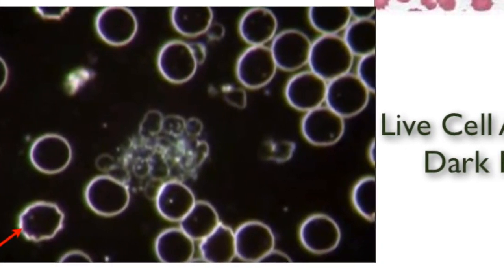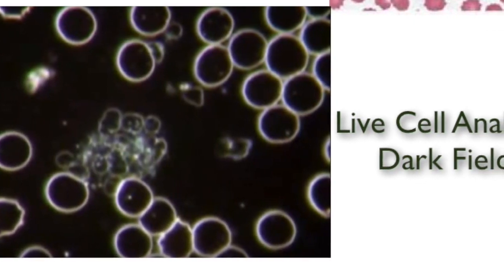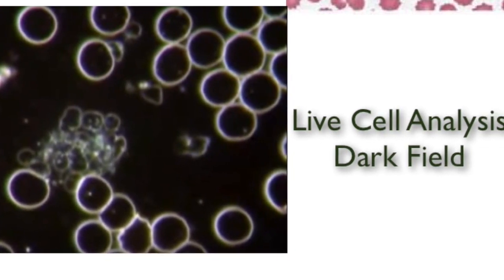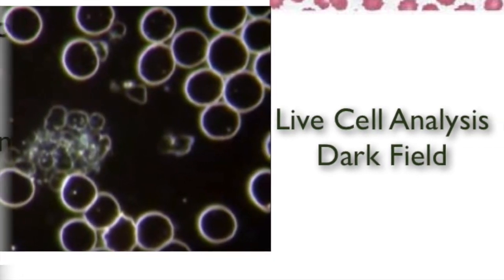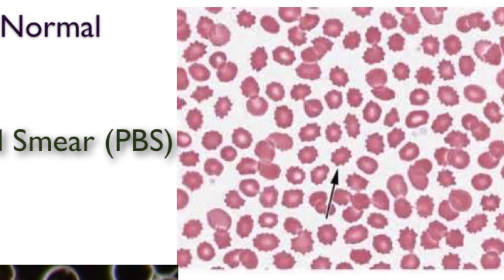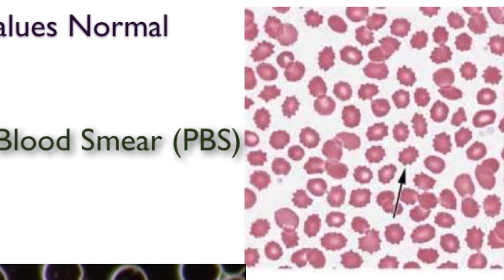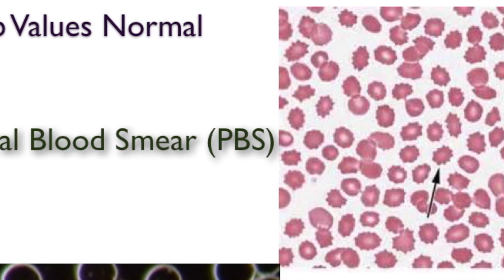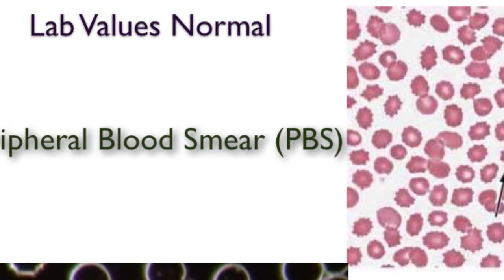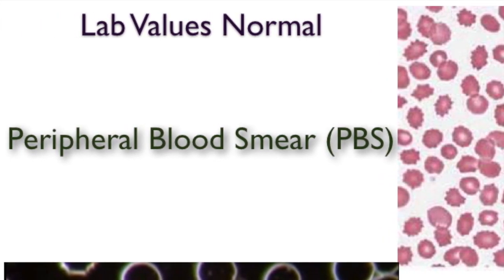These red blood cells are smaller than normal and are referred to as microcytes, and red blood cells larger than normal called macrocytes. The other example is poikilocytosis, and these are various shapes of red cells that may include echinocytes, acanthocytes, elliptocytes, keratocytes, Rouleaux, sickle cells, target cells, teardrop cells, stomatocytes, and schistocytes.